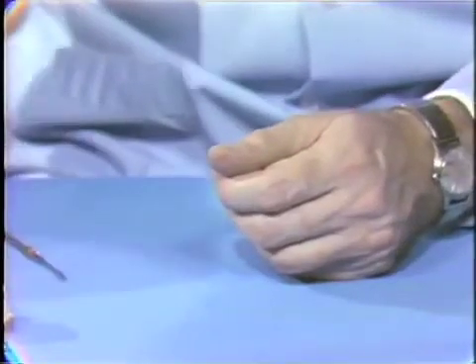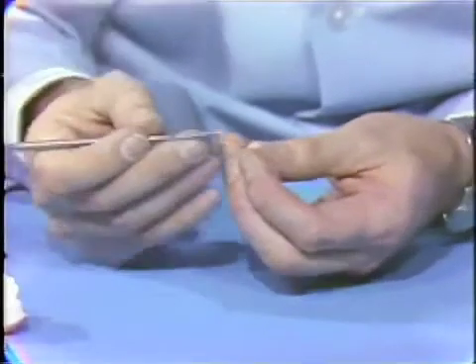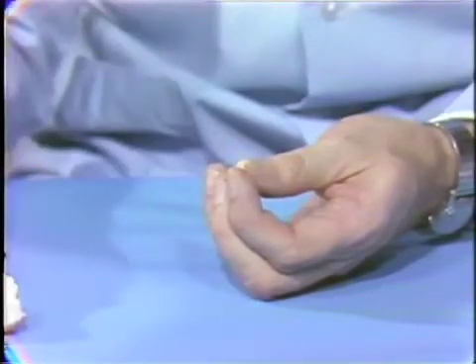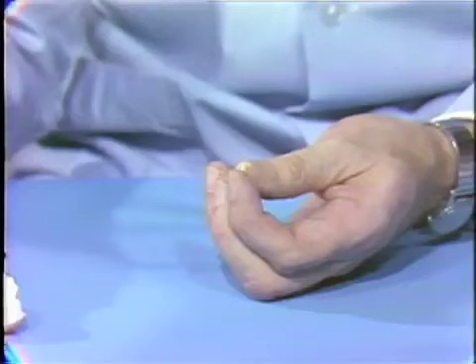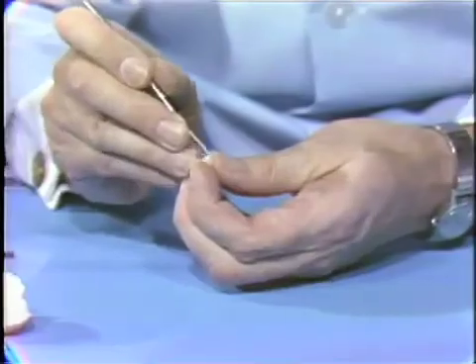more closely. There are two slight modifications that we're going to make to this particular pontic before we adapt the backing. You may remember that because of the lack of adequate space here for the connector, we talked about beveling the porcelain to carry the gold a little down in the interproximal region there.